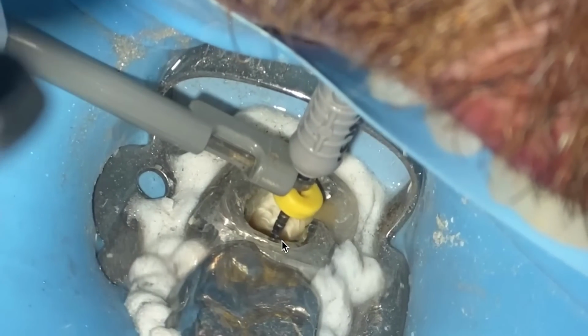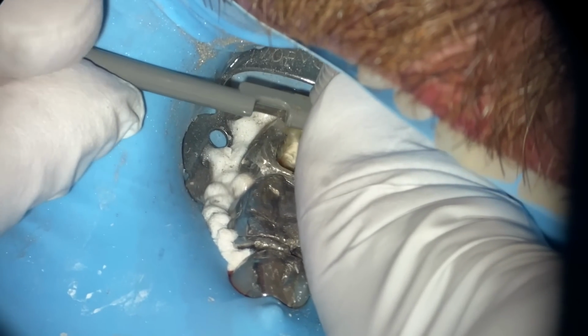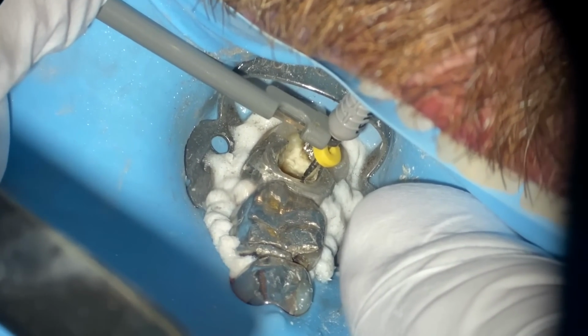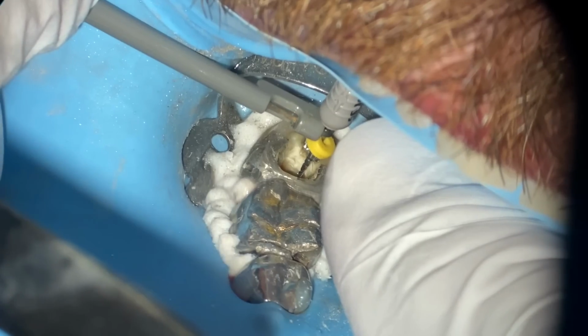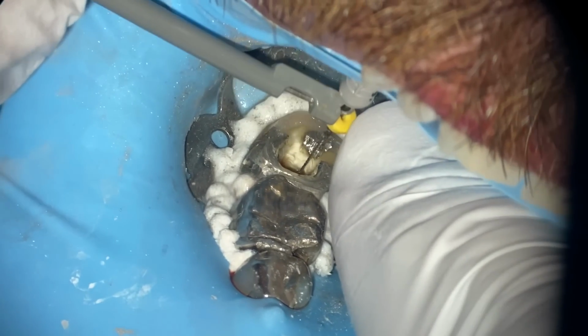So I'm going to move it off the amalgam and then see where I'm at, because the amalgam acts like a conductor. We all know that. Caries, leaky restorations, necrotic teeth with a lateral canal, you can get a weird working length. I mean, all of these things, certainly posterior teeth are not simple. I've been there. So what I'm doing is I'm just trying to fiddle around.